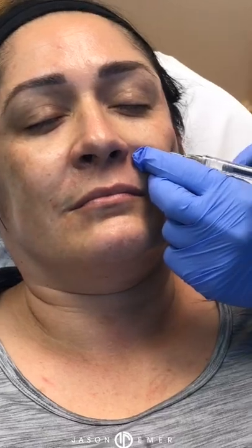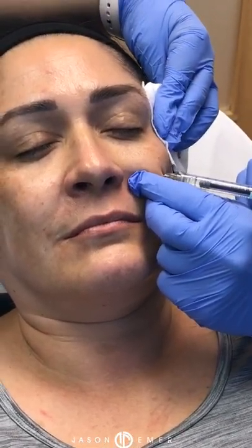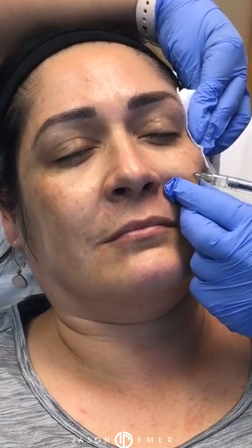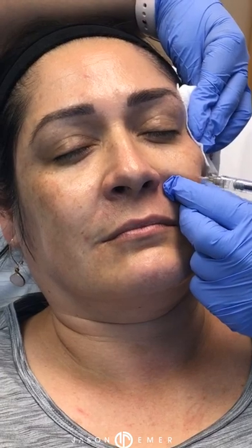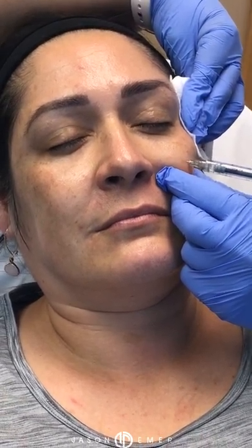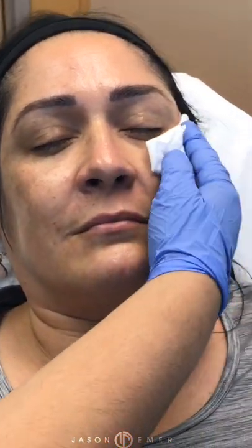Wow. So lateral lifting has been accomplished. Now we're going to go directly to the apple of the cheek. It's a little bit deeper than we were before. And give some pillars to just get some lifting to where the under eye and the cheek meet, to blend. Good. Okay, that accomplishes the task. You can hold right there. I'm going to switch sides. Wow, looks so good. So show one side versus the other so people can see.